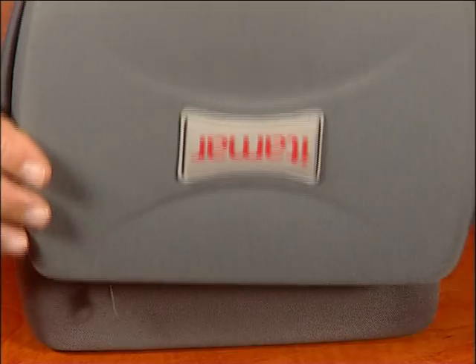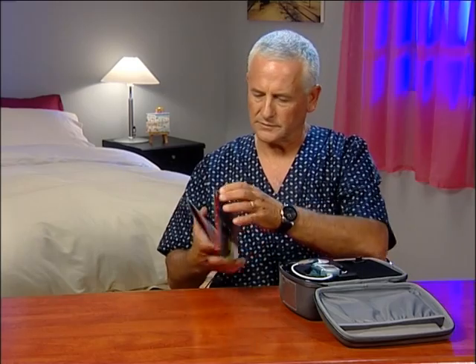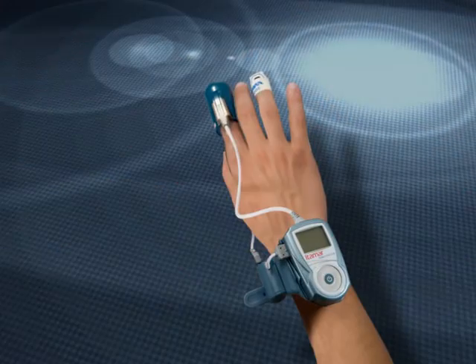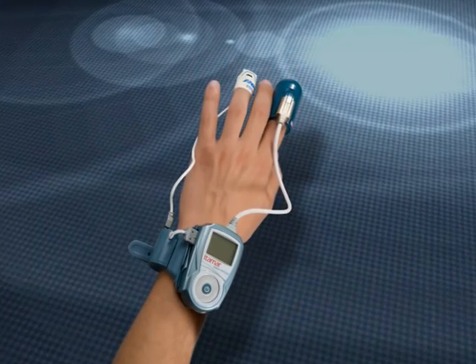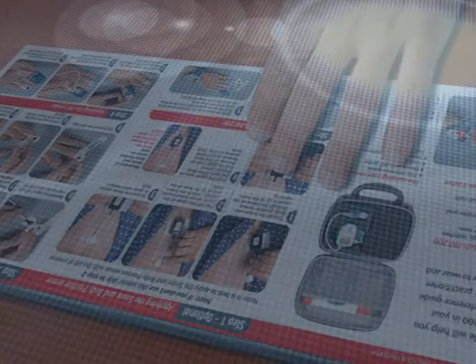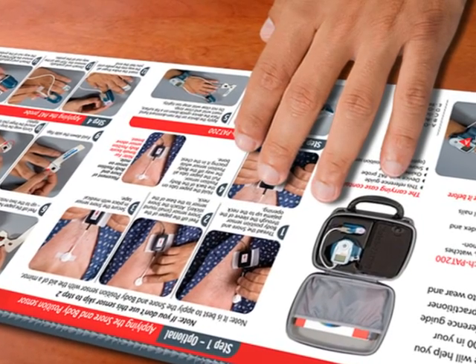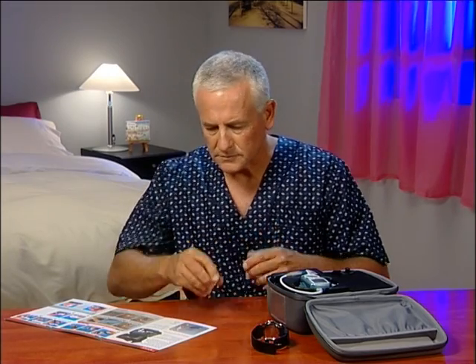Open the WatchPat case. You'll find a helpful illustrated guide in the side pocket. You'll be putting the WatchPat on your non-dominant hand. Here you're seeing how a right-handed person puts the device on his left hand. Make sure the fingernails of that hand are trimmed and without polish. Remove all jewelry and avoid using hand cream.